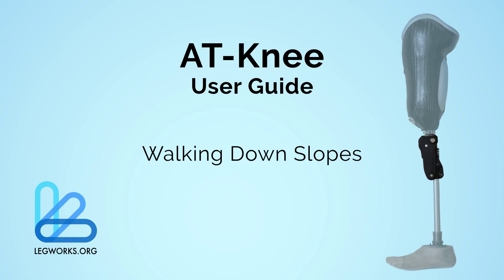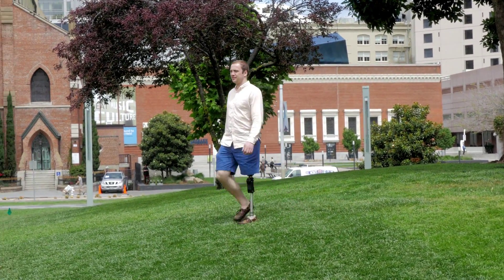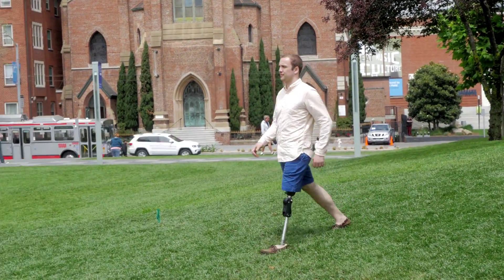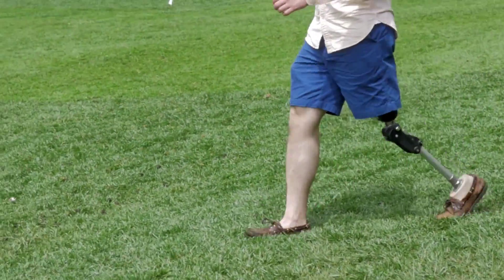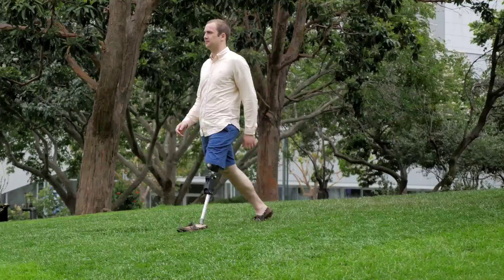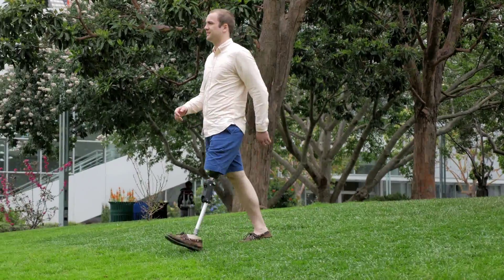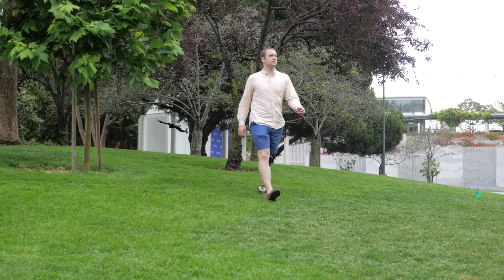For new amputees walking down slopes, or on steep slopes, use a handrail whenever possible. When walking down slopes, it is important to make sure that the AT-Knee reaches full extension. The user then initiates stance phase by loading on the heel of their foot and keeping the weight on their prosthesis side until the toe is loaded and the user is ready to take the next step and swing the prosthesis through.